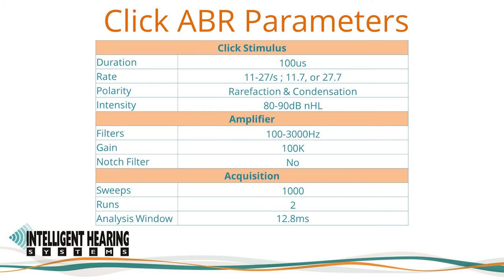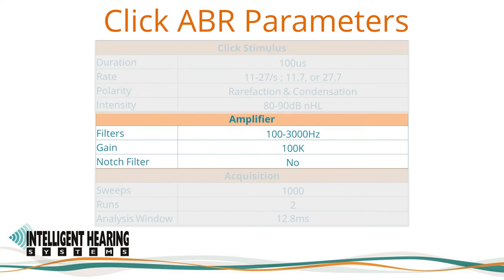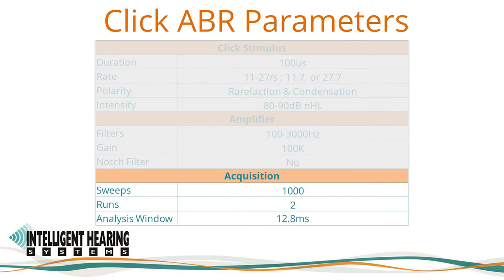Here are the parameters for the Click ABR settings. Click ABRs are recorded using a high-level stimulus — 80 dB NHL, for example — a 100 µs click stimulus in either or both of the two single polarities: rarefaction or condensation, at a rate between 11 to 27 per second — for example, 11.7 or 27.7 — for each ear. The slower rate will enhance wave 1. The recording bandwidth is from 100 to 3000 Hz. The amplifier is set to 100,000 amplification. The notch filter is turned off but can be activated when needed. 1000 sweeps will be recorded for each polarity, and the recording analysis window is set to 12.8 ms.